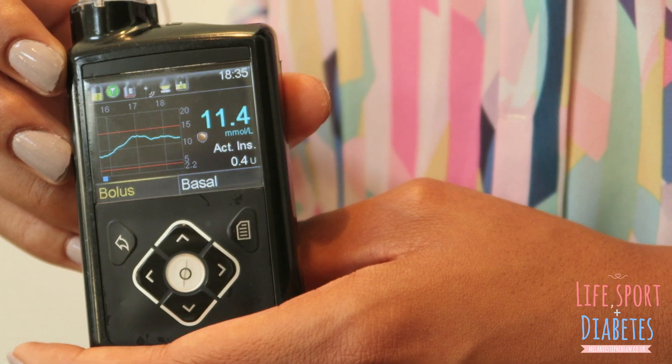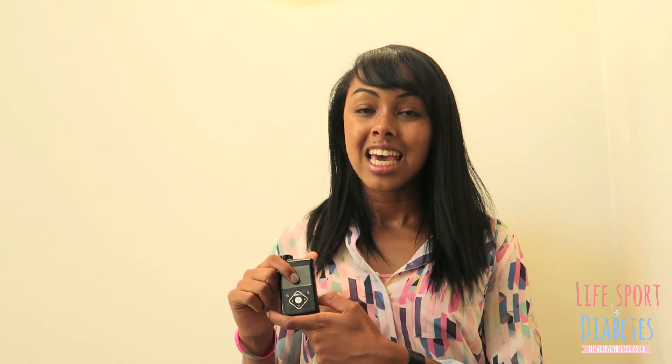This pump is the Medtronic MiniMed 640g. I've been trialling it for the last two weeks — I didn't want to do a blog straight away when I was still getting to know the pump, because I wanted my body to get to know it before I could give a true reflection on what it's been like.